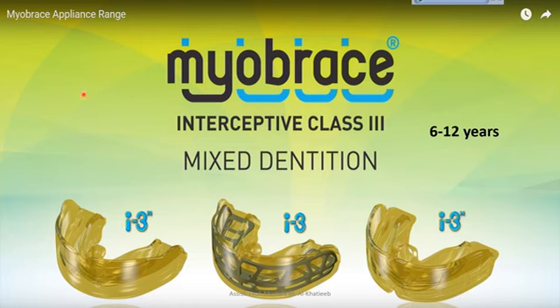Interceptive class 3 is used in the mixed dentition for class 3 cases between the age of 6 to 12 years. As we said, there is interceptive 3N, interceptive 3, and interceptive 3H.